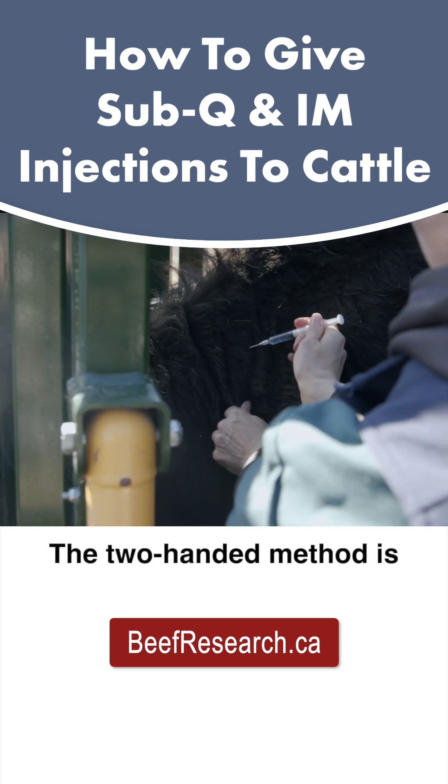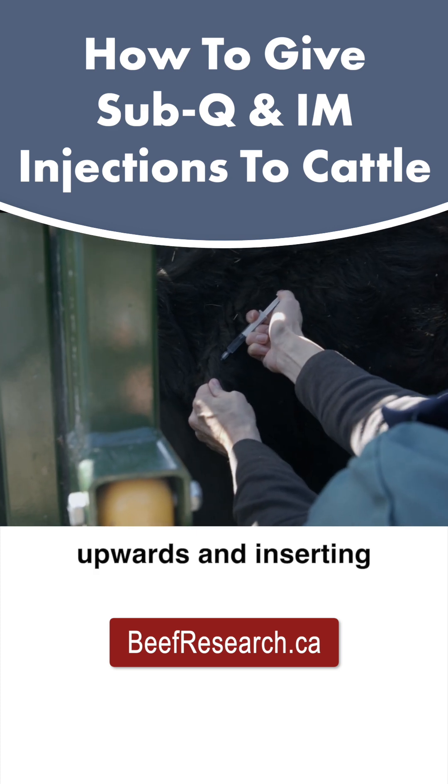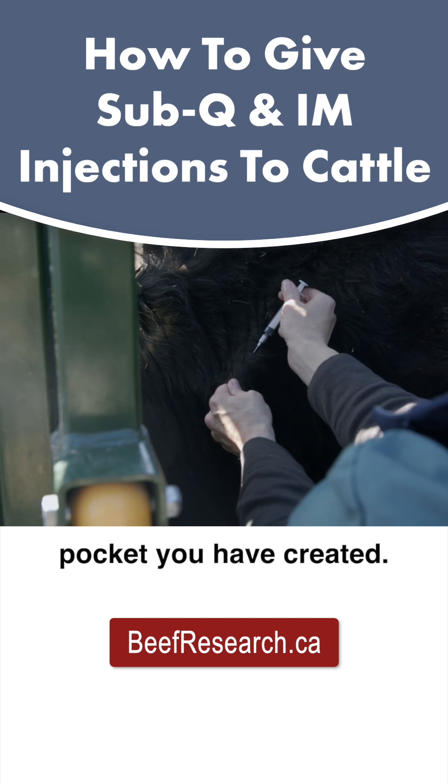The two-handed method is accomplished by first creating a pocket with your free hand, by grasping the hide and tenting it upwards, and inserting the needle into that pocket you have created.